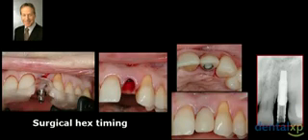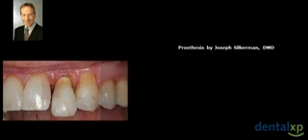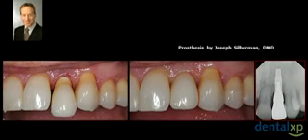Because when you go to seat an immediate provisional restoration, whose axial alignment may interfere with the marginal ridge contacts of the adjacent teeth, you want to rule out the variable of the implant coupling with the temporary cylinder, so that your only restorative issue now is managing the interproximal contacts. So here we are now at the completion of this patient's treatment. And this was completed over about a 4-month period of time. Again, very similar to what Scott presented. So it's not that we're showing you things that aren't done on a consistent basis.